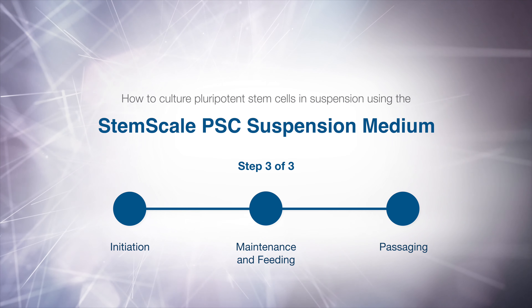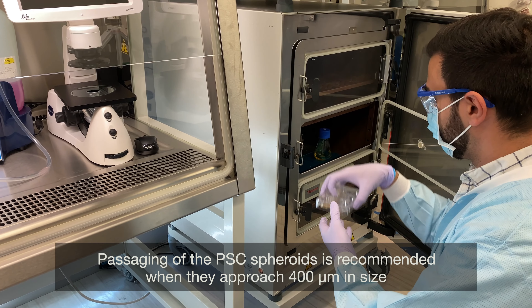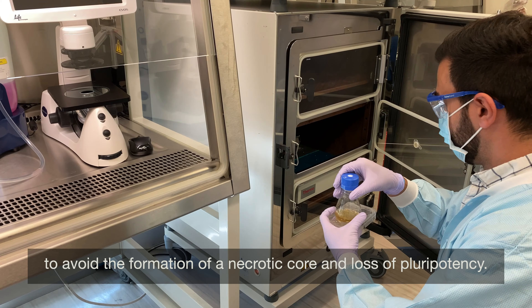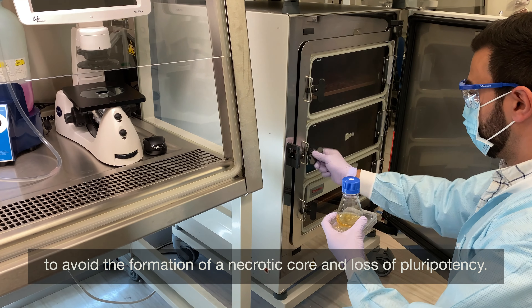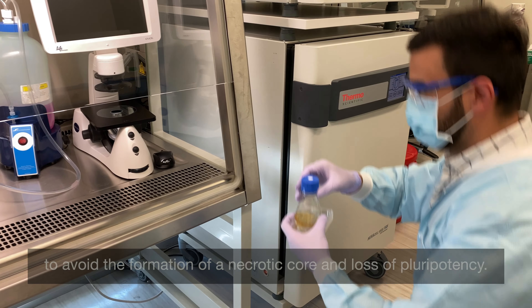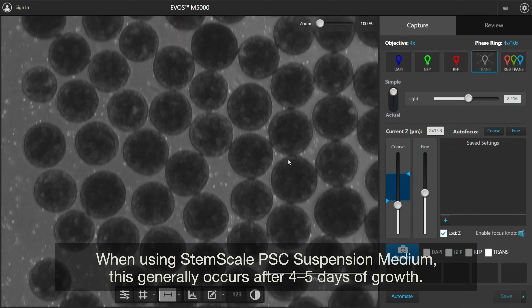Passaging of StemScale PSC suspension cultures. Passaging of the PSC spheroids is recommended when they approach 400 micrometers in size, to avoid the formation of a necrotic core and loss of pluripotency. When using StemScale PSC suspension medium, this generally occurs after 4 to 5 days of growth.